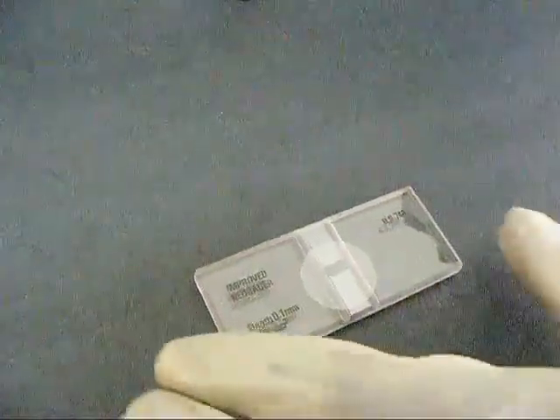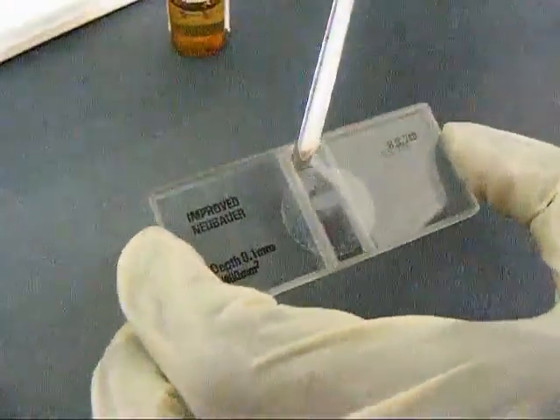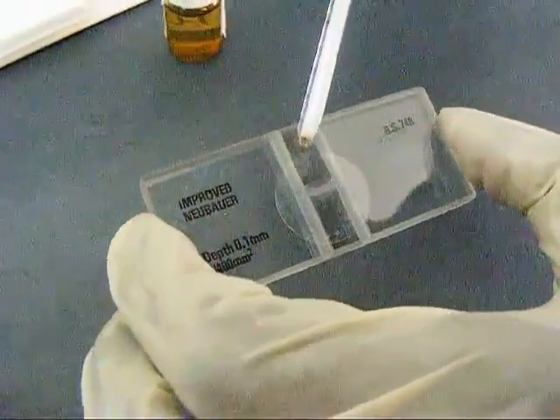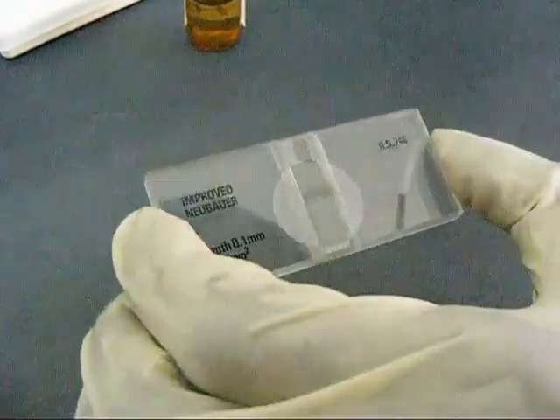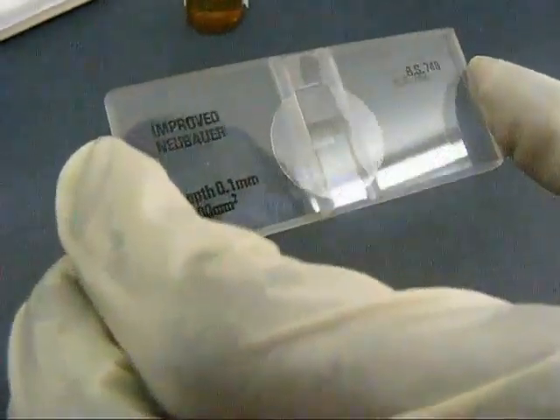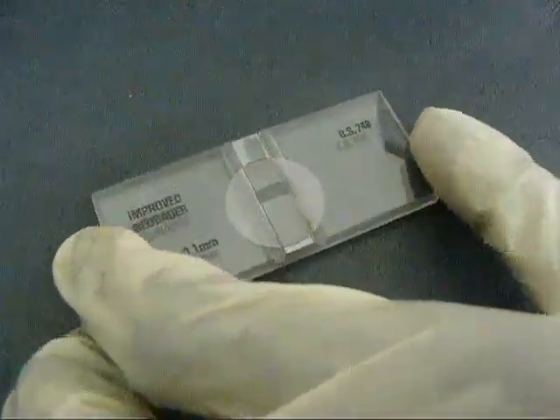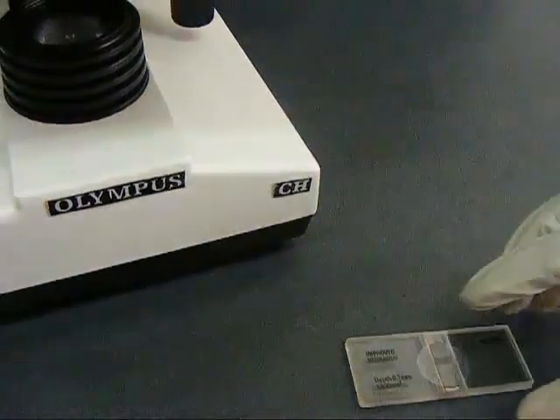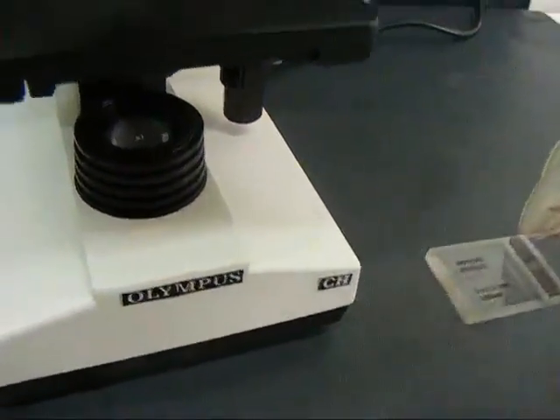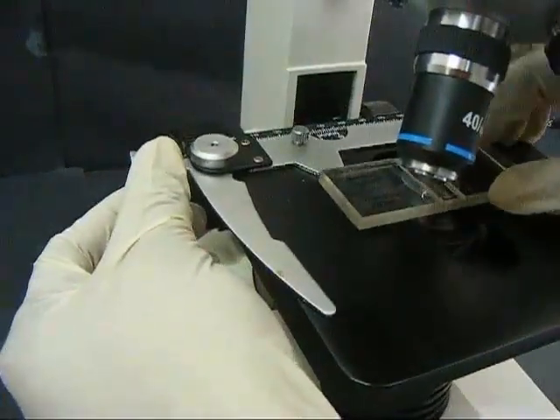The counting chamber is then filled with the diluted blood. The hemocytometer is mounted on the stage of the microscope and various adjustments are made for suitable viewing.